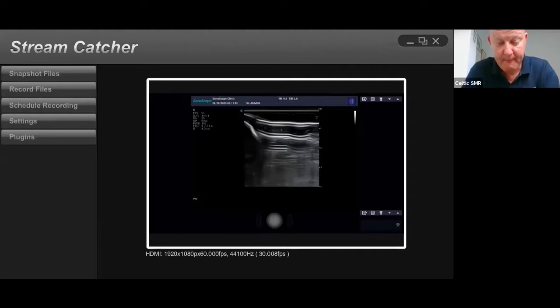Okay, so the first thing to do when we look at the shoulder is to get the right position. So I'm going to go through that first. There are two different positions for the shoulder, specifically to look at the supraspinatus. One of them is called the crass view, and the other one's the modified crass.